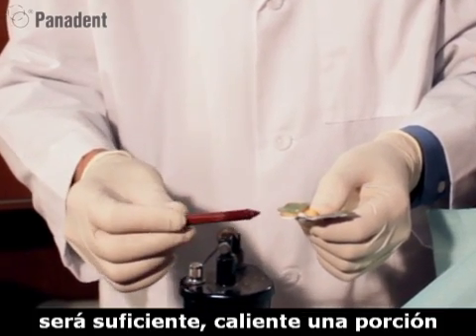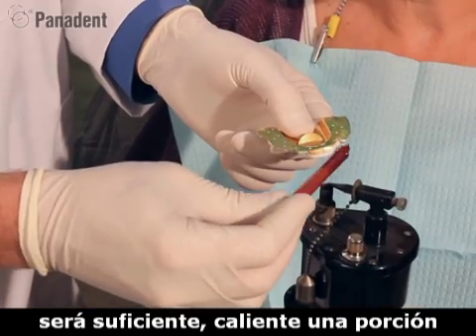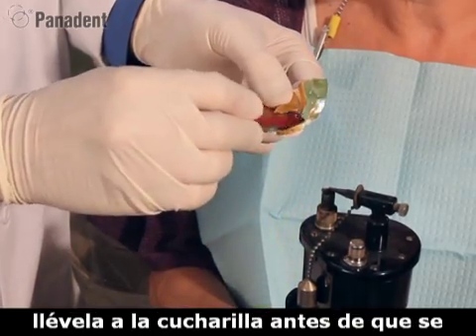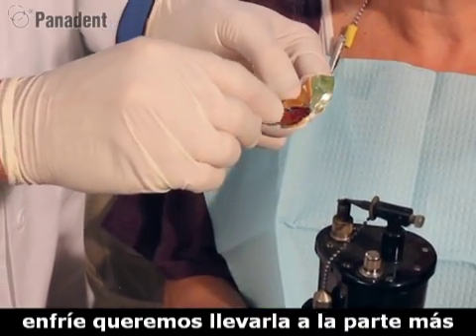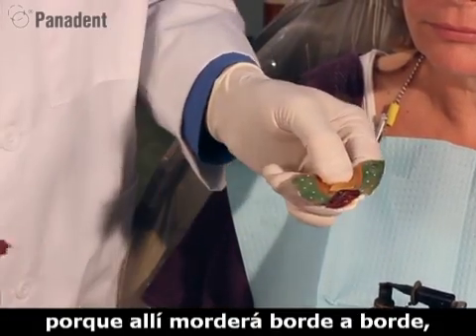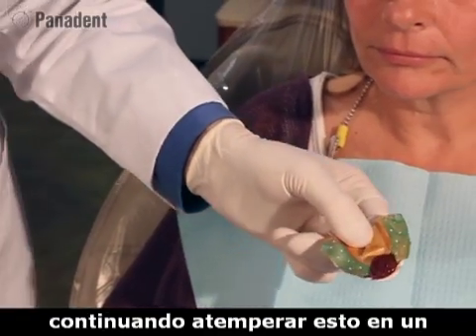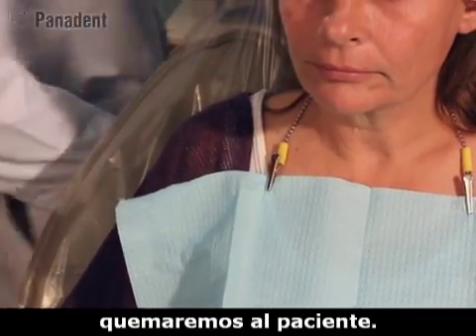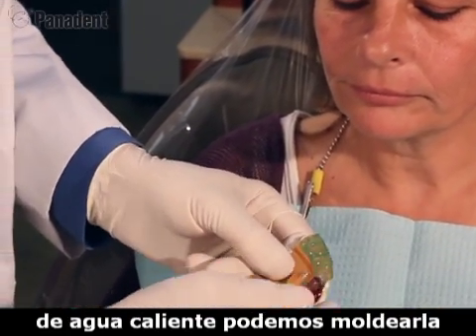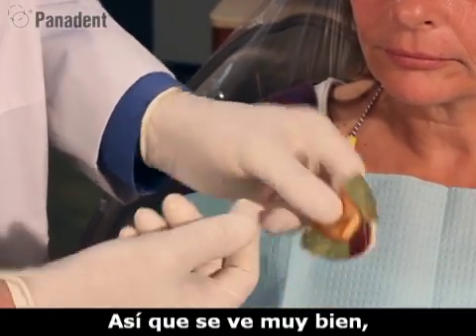Again, a little dab won't do you. Get a nice section of this heated up really good. And just as it starts to slump, come right over to the tray, smoking hot. And you want to come right on out to the front of the tray with this too, because that's where they're going to be biting more edge to edge. We'll go ahead and temper this in hot tap water just so we don't burn the patient. After tempering in hot tap water, I can even mold this a little more anteriorly on the tray if I need to. So that looks pretty good.